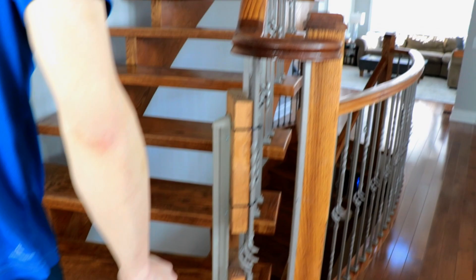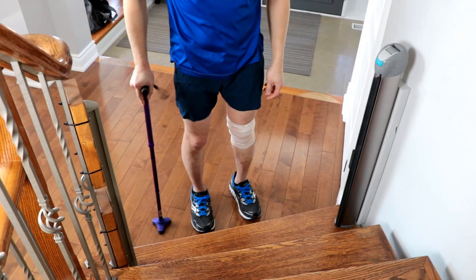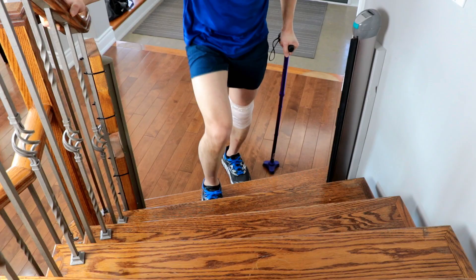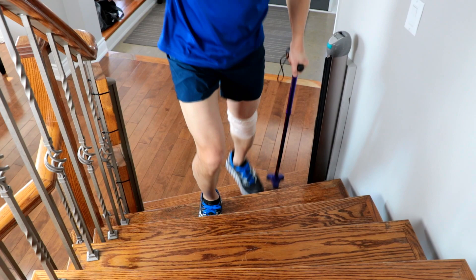When there's a railing available, you may wish to take advantage of it. To do this, simply grip the cane with the opposite arm. The cane still moves with the injured limb and the railing can be used for additional support.